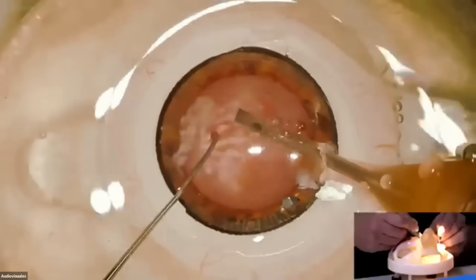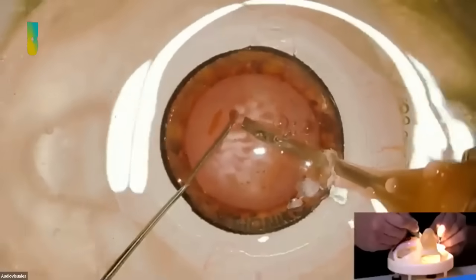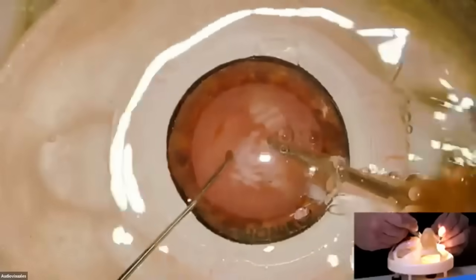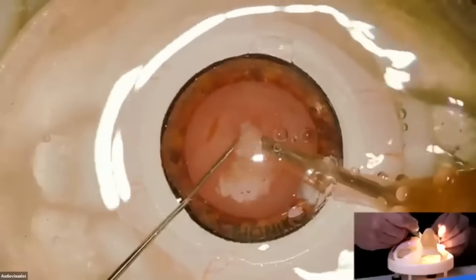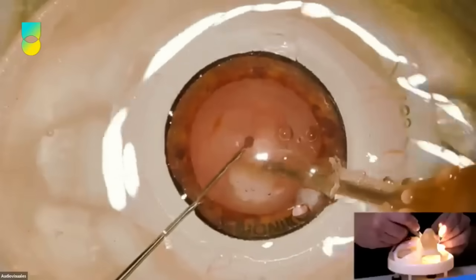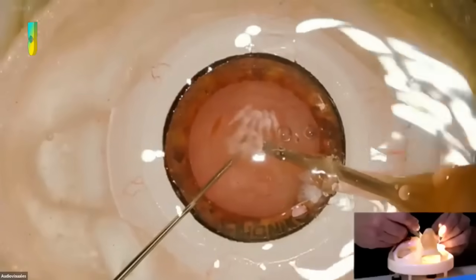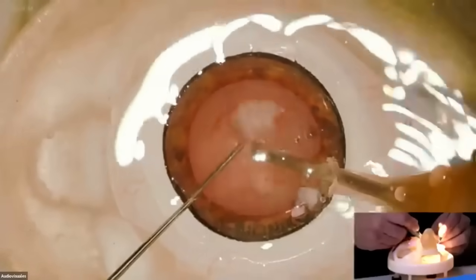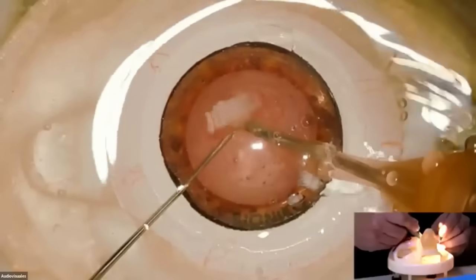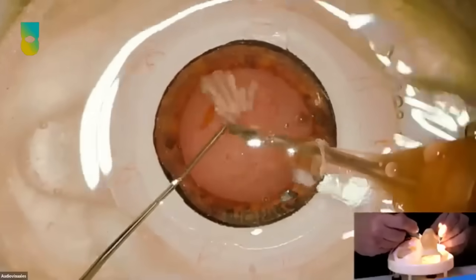Very good advice, Cecilia. And you need to remember that this is behaving like a very hard cataract. Yeah, I know. But he's doing a great job. We've been there so many times. You have those little pieces going around everywhere, and they damage the cornea. Those loose fragments are responsible for most of the corneal edema you see the next day. So you don't have to let them go around freely. Pablo did a very, very good job.